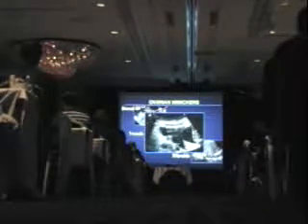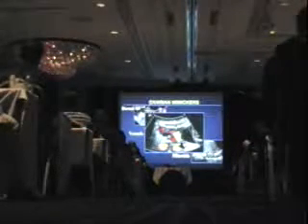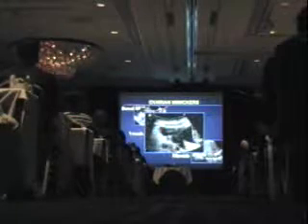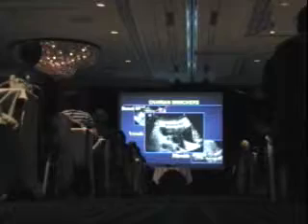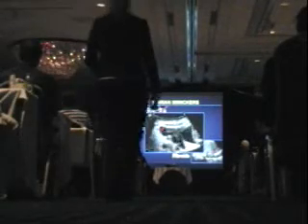If you have vessels, sometimes color will help you. It makes a pretty picture. You don't really even need color. You just need to sharpen the gain a little. See the vascular flow, such as I showed you a couple of days ago in that portal vein. You can read it. Usually it's venous flow that's going to get you into trouble and mimic an ovary. Also with the probe, a vein will collapse. You do it all the time in the legs. The same thing is true in the adnexa.